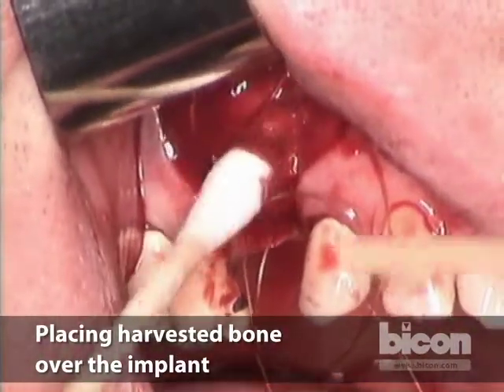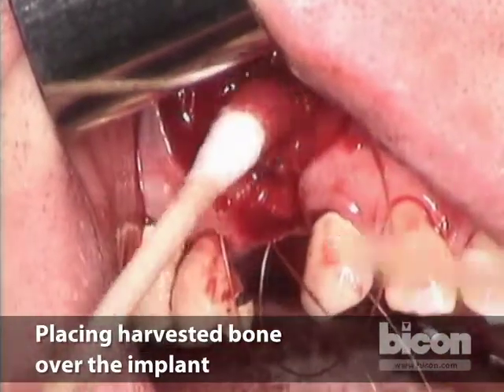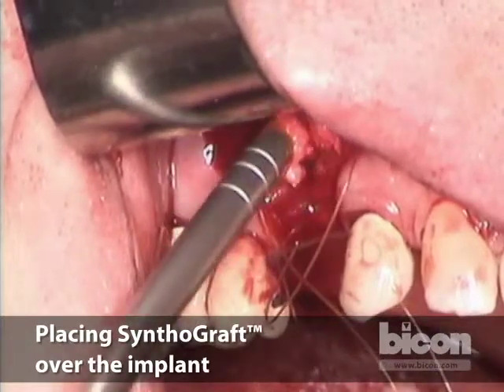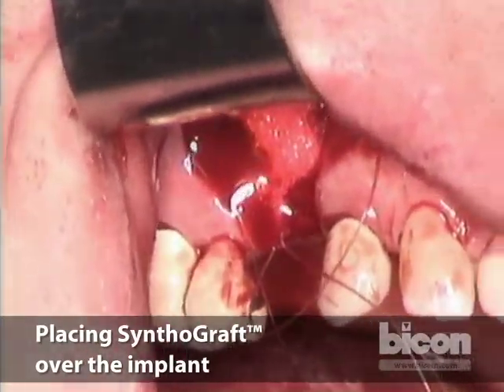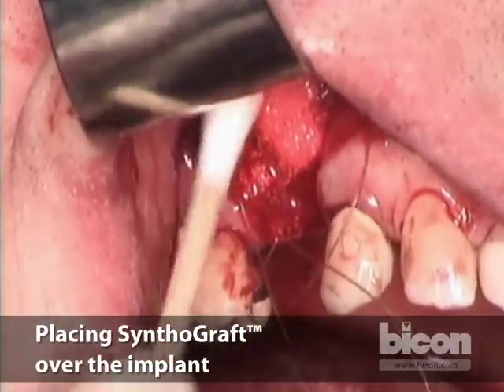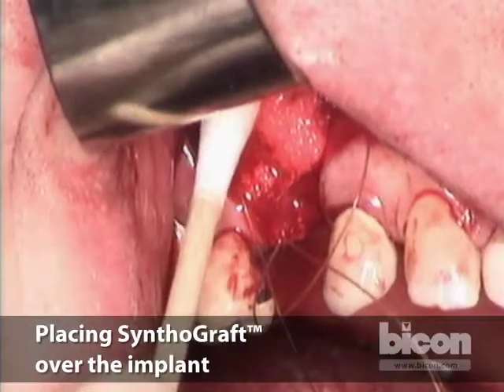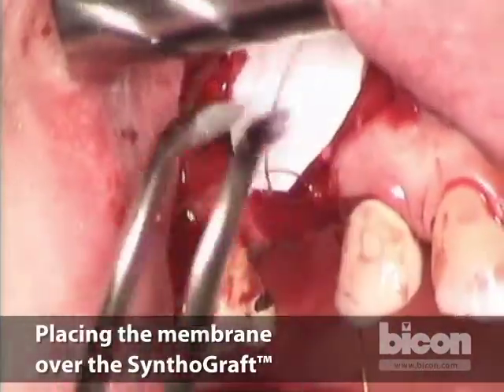So we have a little bit of bone. It's autogenous bone. And this will be pretty much most of that 1/4 gram. It'll just go as a second layer. Okay. I'll take the Q-tip. And then I will take tissue forceps. We'll position the membrane right over the graft.